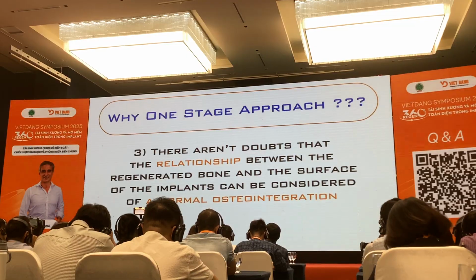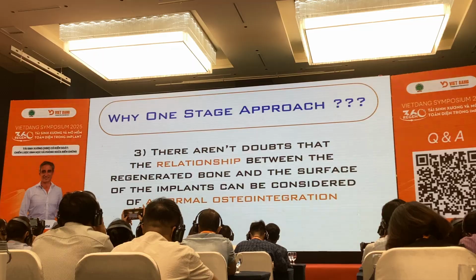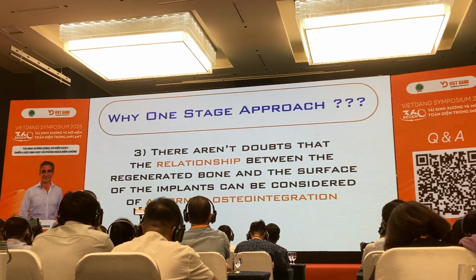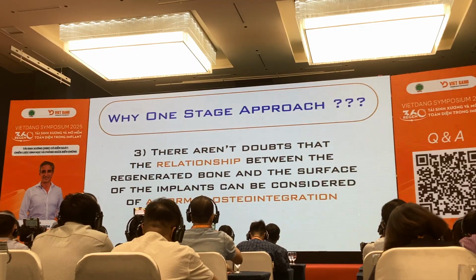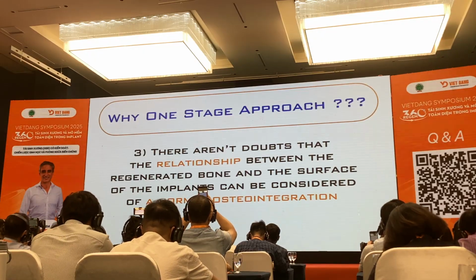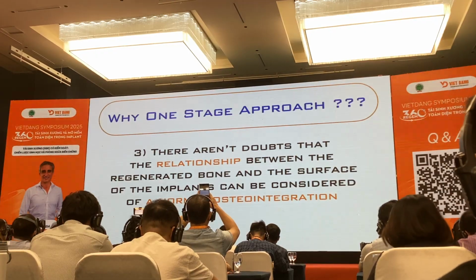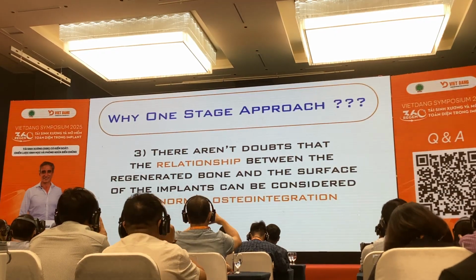And then there isn't any doubt that the relationship between the surface of the implants and the regenerated bone is a true osseointegration.